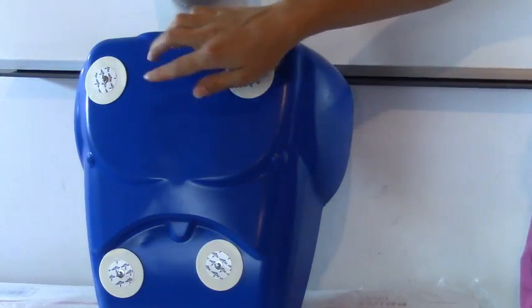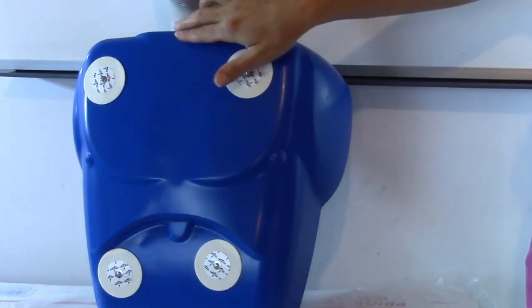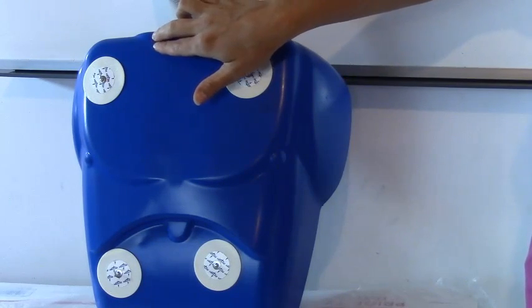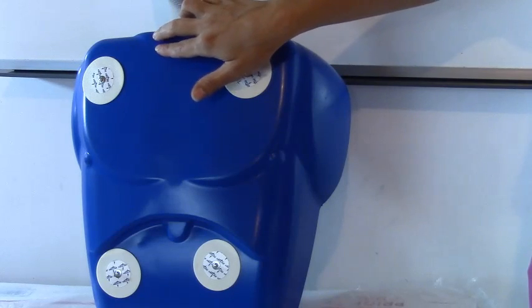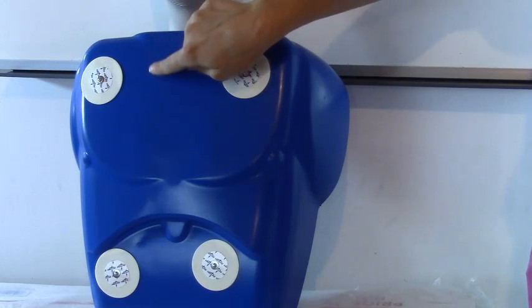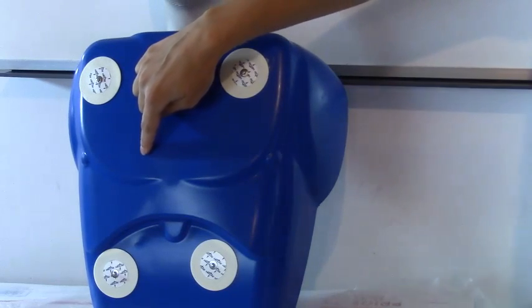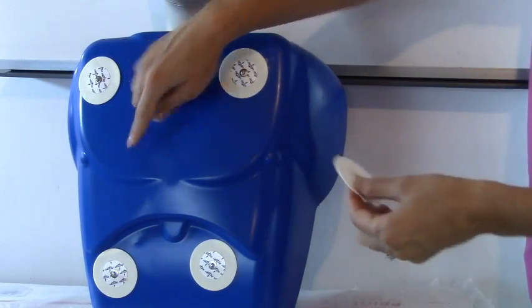Now let's do our chest leads. First what we're going to start with is V1. You're going to find the sternum which is in the middle then you're going to count the ribs and we're going to go to the fourth intercostal space right of the sternum. So you're going to count the ribs. So about right here would be our fourth intercostal space and that is going to be V1.